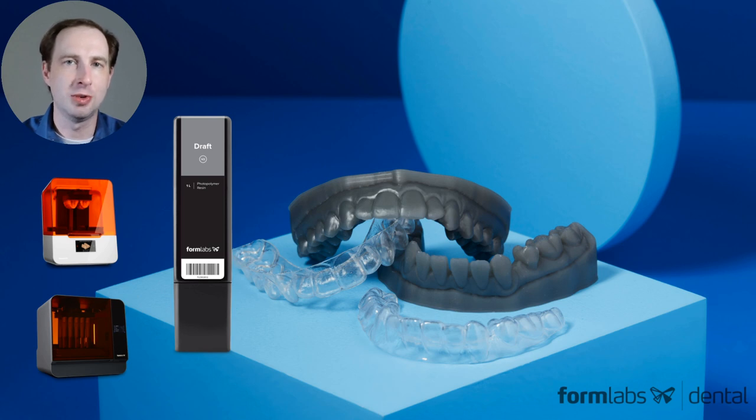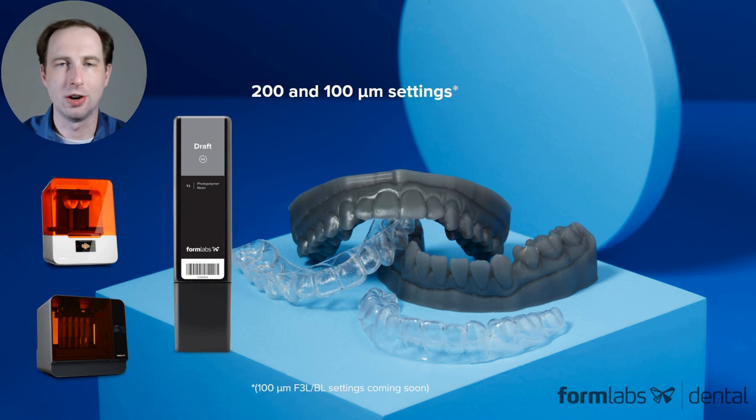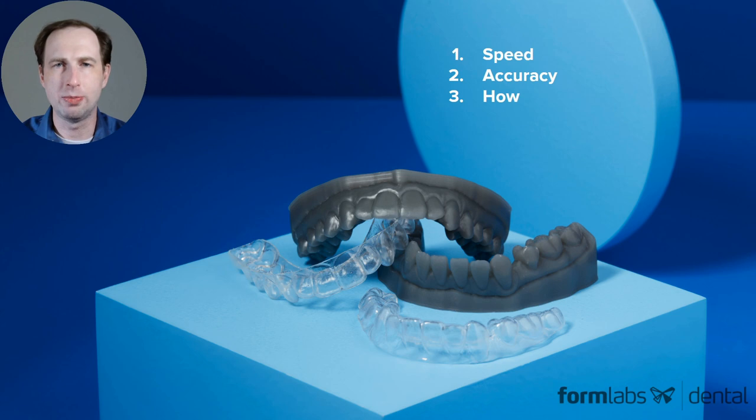Draft Version 2 is a new material for dental models and it is extremely fast printing. It comes in 200 and 100 micron layer settings. Today I want to go through the speed, accuracy, and how we did it.